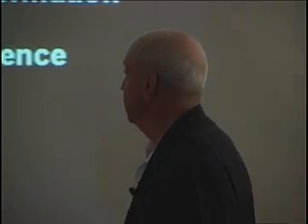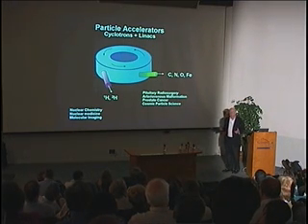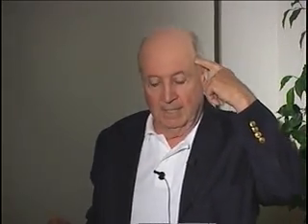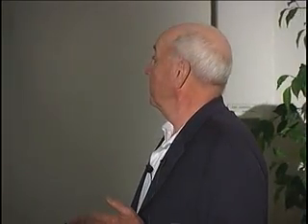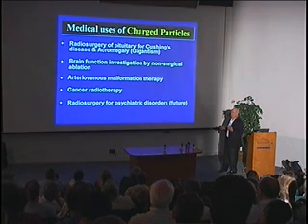So let me move now to something that many people do not know about at this laboratory, certainly not at other laboratories, and DOE's completely forgotten it, and that is the use of charged particles for therapy. One of the early approaches pioneered by John Lawrence is pituitary radiosurgery. That is to ablate the pituitary without having any surgery and thereby control diseases such as acromegaly, Cushing's disease. So this is Cushing's disease, but also one could control parts of the brain function by ablating particular areas.